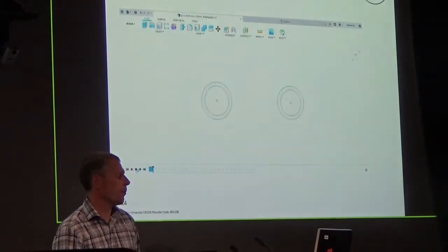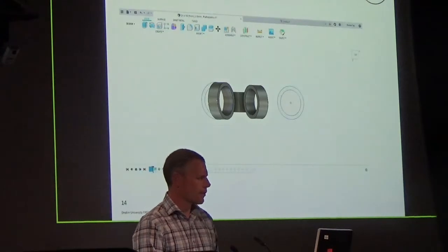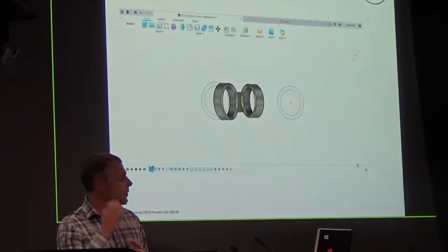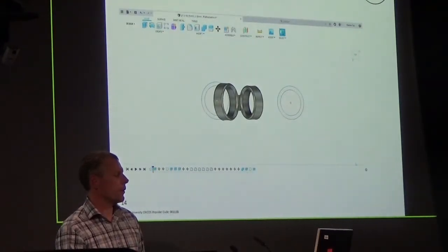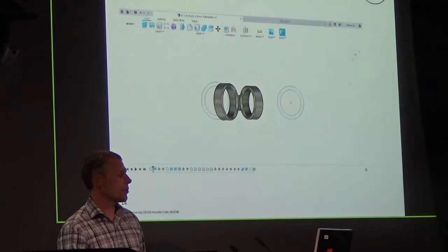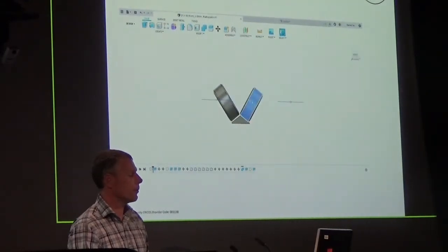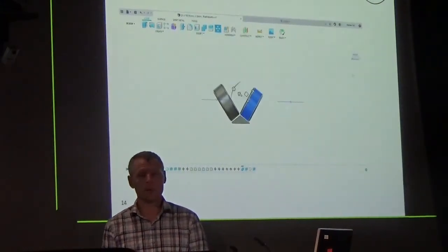What does happen if you've modified the splint? Here it goes again. Whenever you've modified the splint, it means the circle sizes have changed slightly, which we'll see in a second. So if the circles have changed slightly, you might need to change slightly the distances that they are. You can see they're slightly away from the triangle that holds them in position. So I just need to change that and put them back into position.